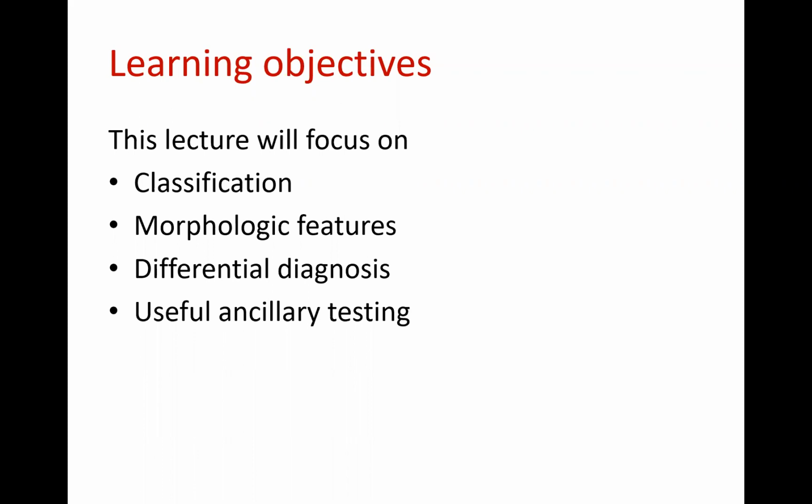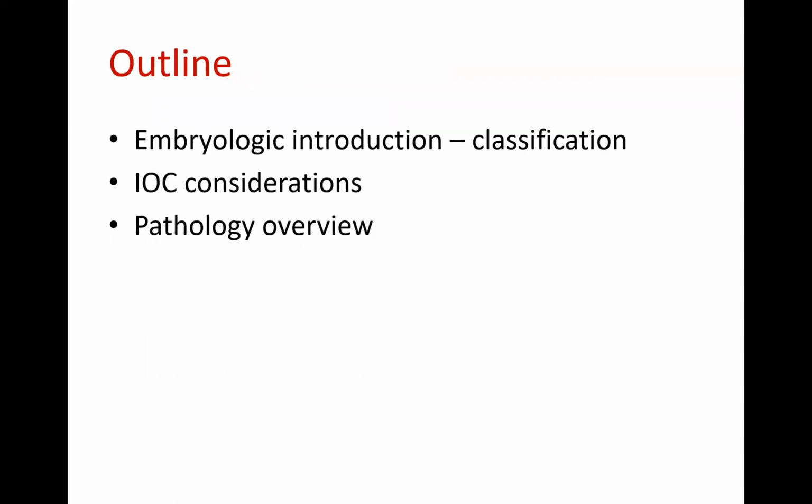So this lecture will be very focused on H&E and morphology. I will not talk much about the clinical aspects, and I will not talk much about therapy, but we will focus on morphology here. We will start with an embryologic introduction that helps us with classification. We will talk a little bit about intraoperative consultation, and then we will dive into the pathology review of all the entities in this category.